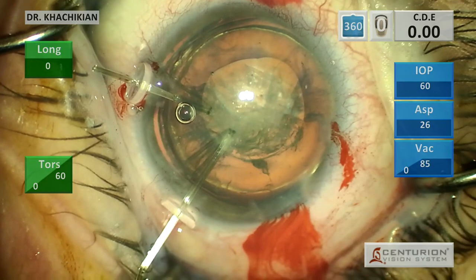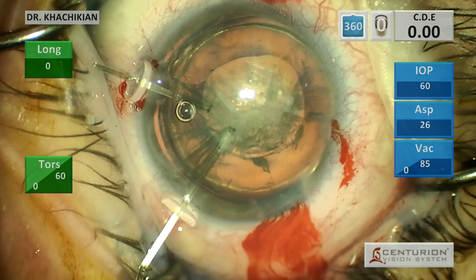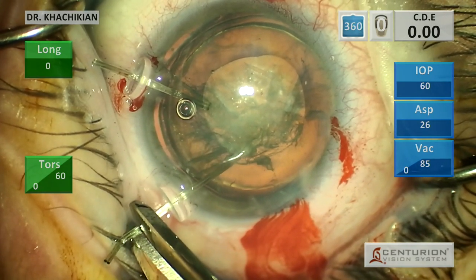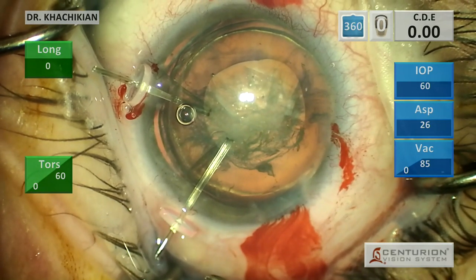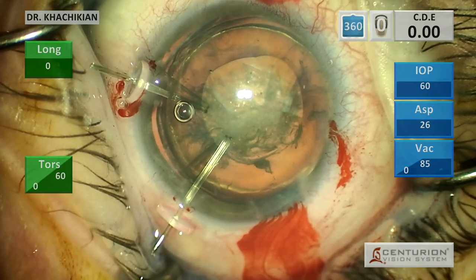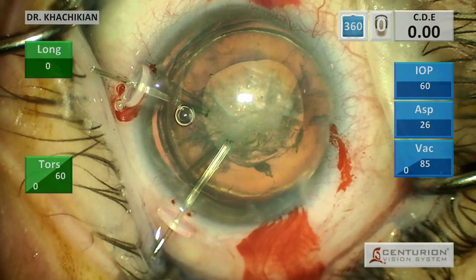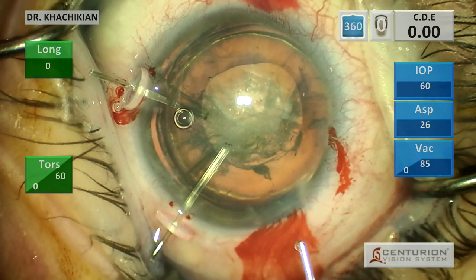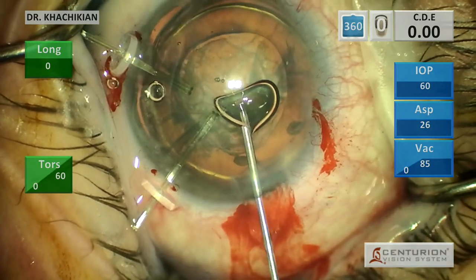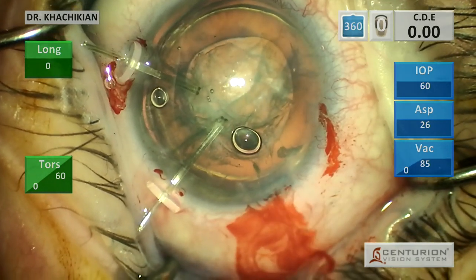A little tip here: the hook ends - and this goes for both capsular hooks and iris hooks - the hook ends can be a little bit long, and they can bounce up against the lower lid or the lid speculum. If that's happening while you're operating, that's going to cause turbulence or movement inside the eye, because the lower lid is going to be hitting on the hook - it acts like a fulcrum. So just clip the more proximal end of the hook that's outside the eye, shorten it. That will reduce the likelihood that the hook will bounce up against the lower lid and reduce the amount of turbulence inside the eye.